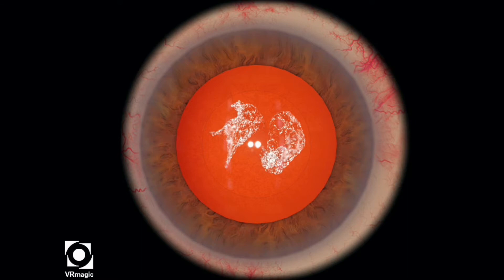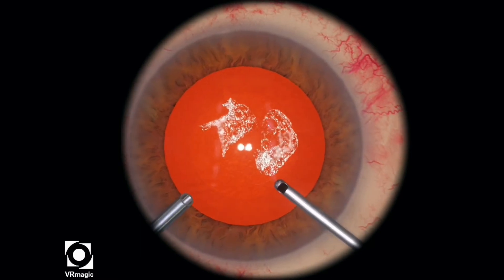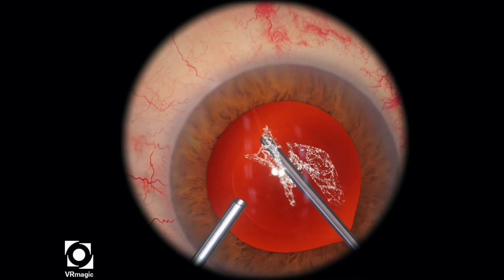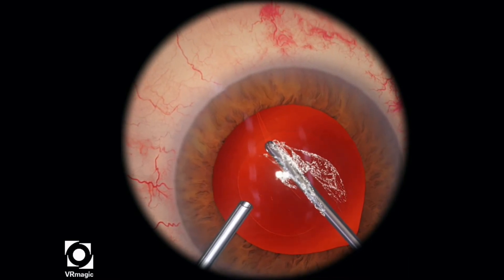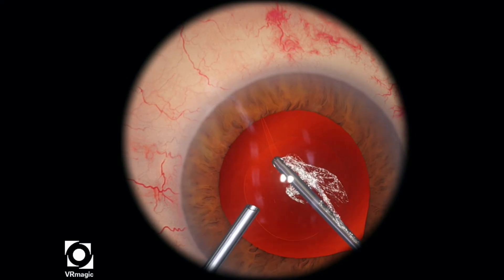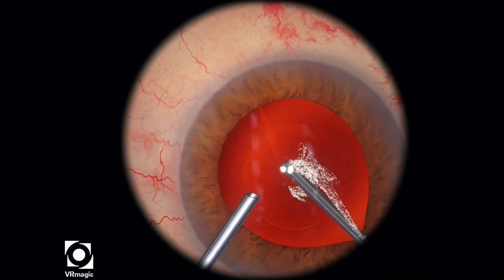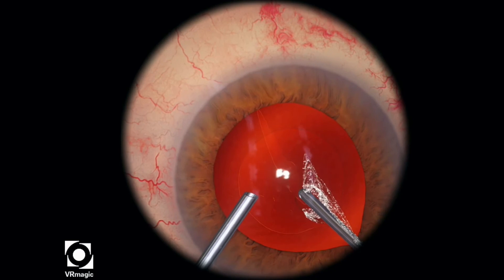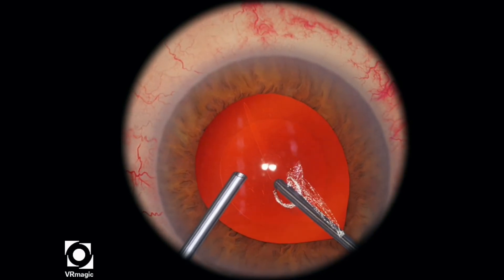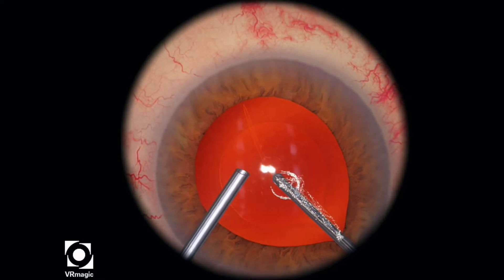In this particular level, your job is to clean up the rest of the vitreous that's gone through the posterior capsular rupture. Put in your irrigation handpiece first, and then start off from the very base. Some of the vitreous will start to leak towards your vitrectomy handpiece, like it's kind of streaking over there, but that's okay. You want to try to ignore that and instead focus on getting all the vitreous that's behind the posterior capsule first.